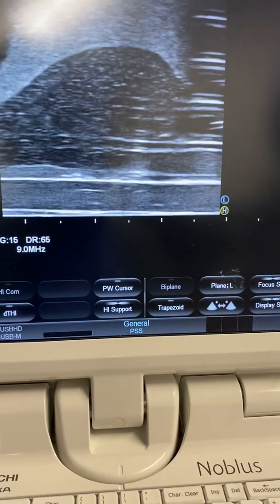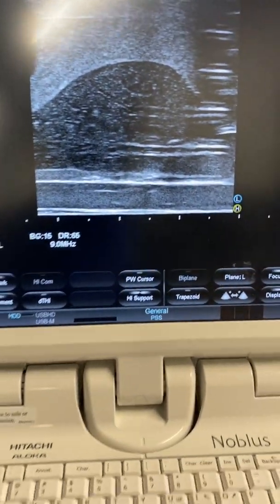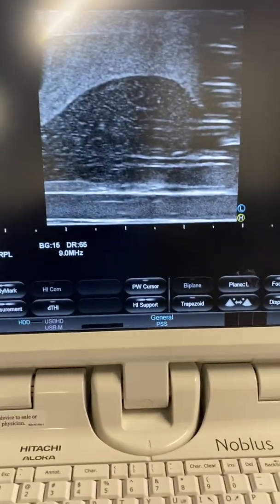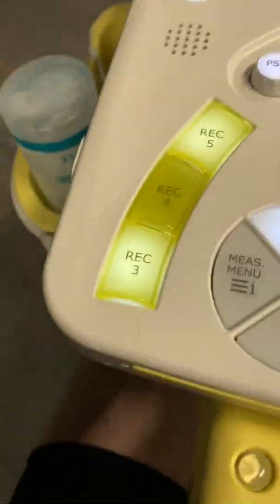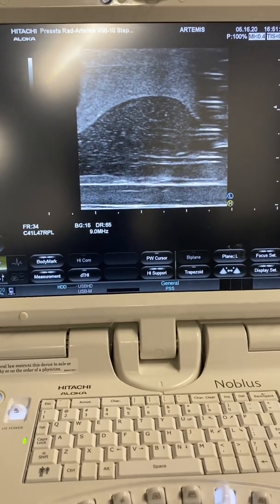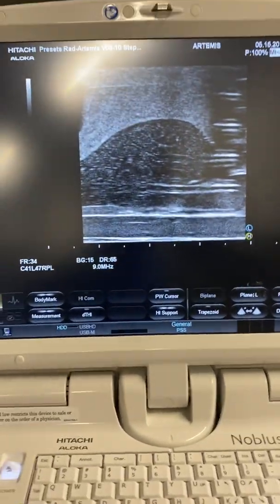They'll check on sagittal, making sure the gel spread from apex to base. They may ask you to take a picture — hook up the printer and press the record-three button to print. Typically you'll print one before the injection and one after, so you should have a nice picture of the pre and then one of the post. Make sure you're printing before they inject, then print one after.